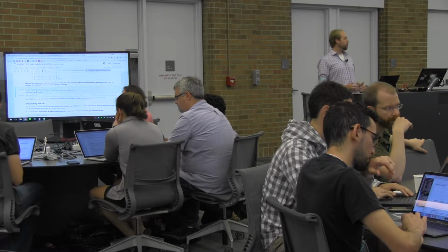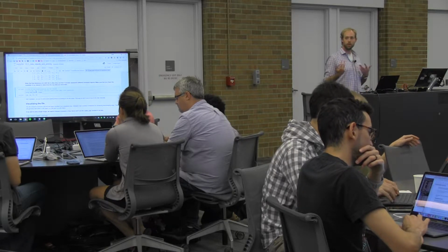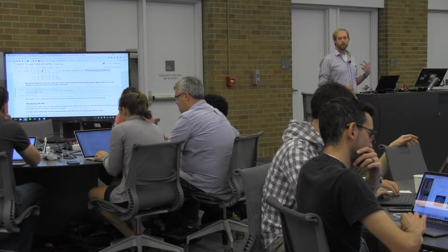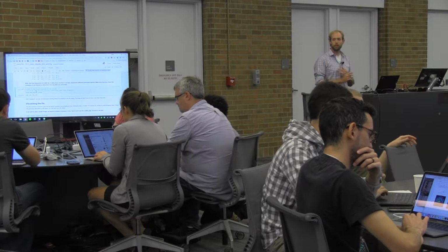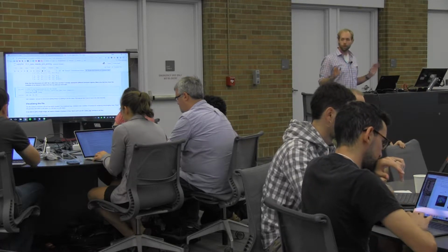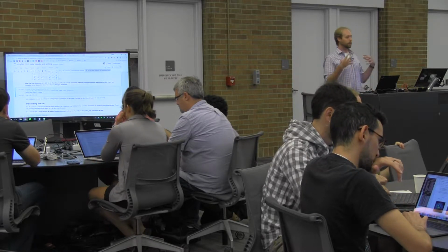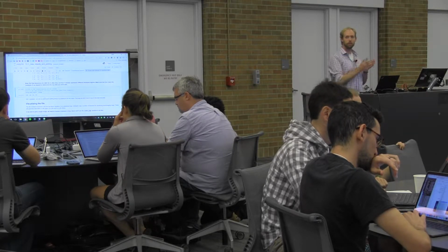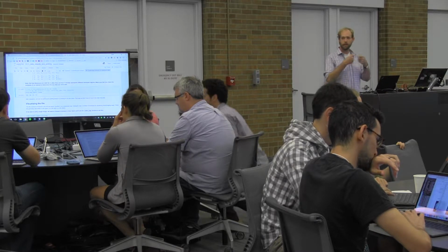Neuroimaging data usually comes in two different possible shapes, 3 dimensions or 4 dimensions. Those correspond to XYZ or IJK, and some 4th dimension. Sometimes that 4th dimension is time. Sometimes that 4th dimension is trials or conditions or whatever. But that's a common pattern that you see, and something that's assumed in the NiBabel neuroimaging stack. The first 3 dimensions are always space, and the last dimension is some other thing that you may want to index into.